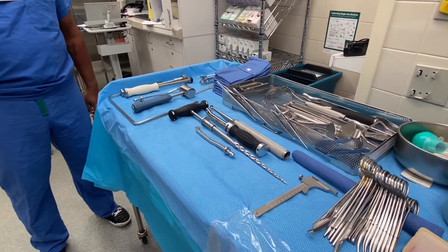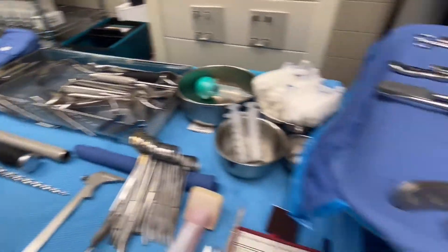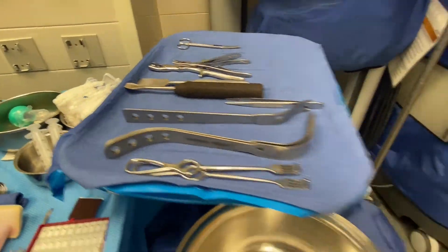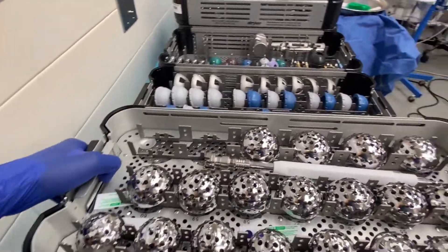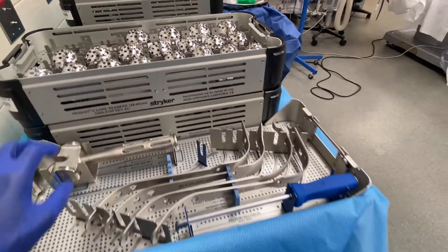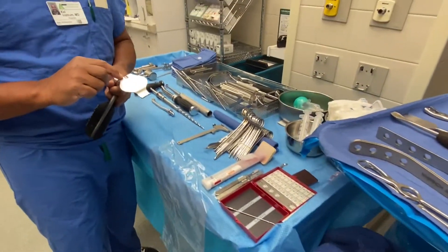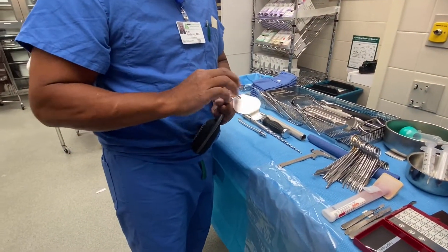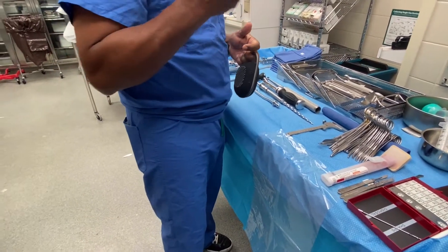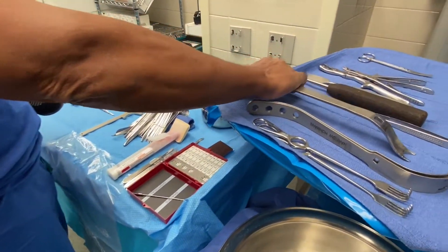Then we turn to the femur. Once we start the femur, I use the cobra retractor — one of those from the last case. I also use, if you have them somewhere in this hospital, Bennett retractors that aren't this wide — a little bit smaller but not as wide. That's what I use with the cobra, and then I use this for the proximal femur.